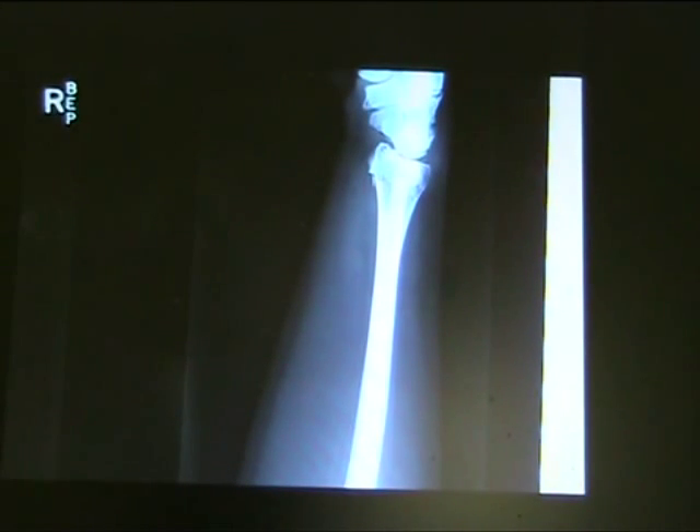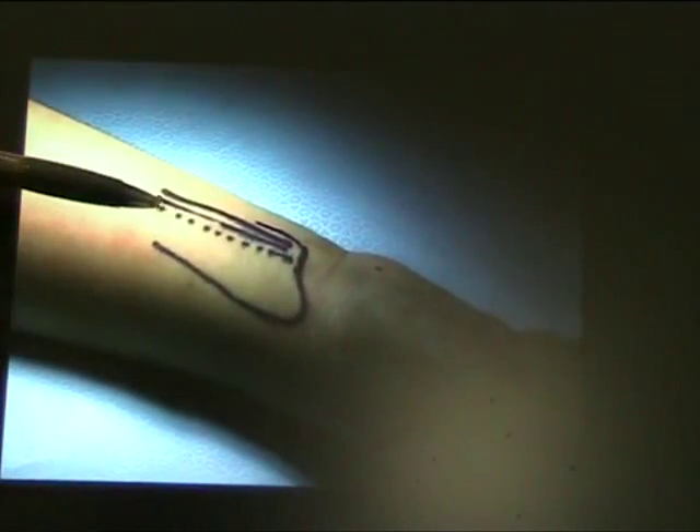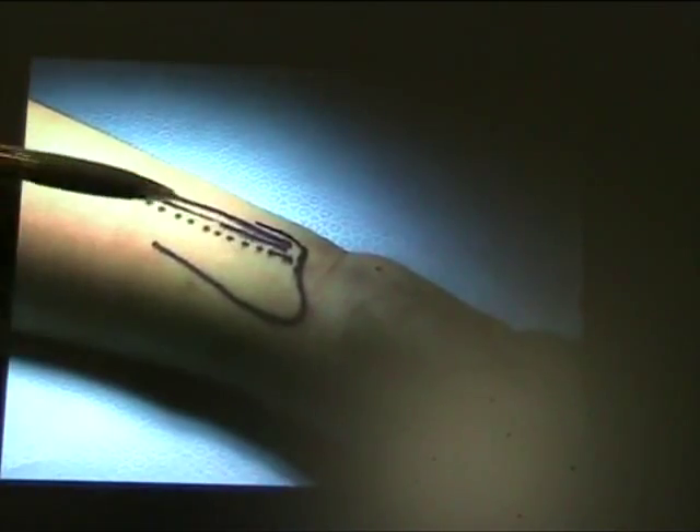These x-rays are very useful. Young patient, dominant arm. FCR is our guide to incision — the FCR tendon.